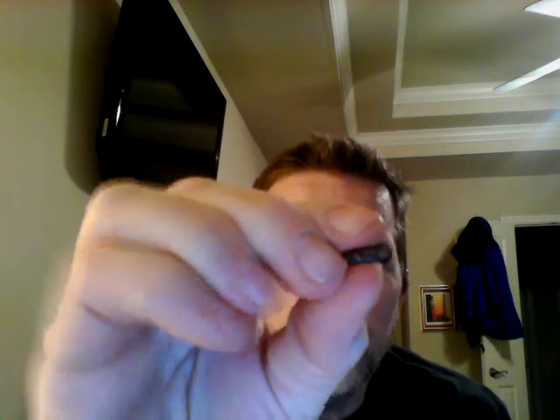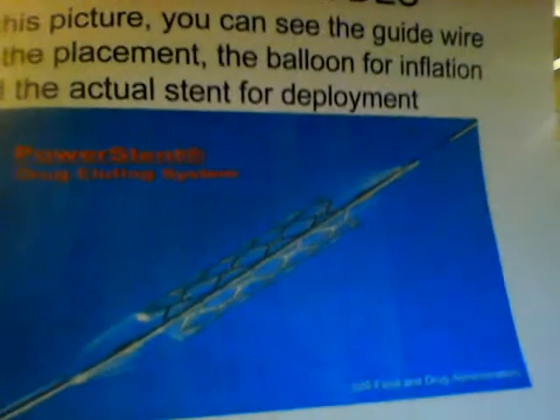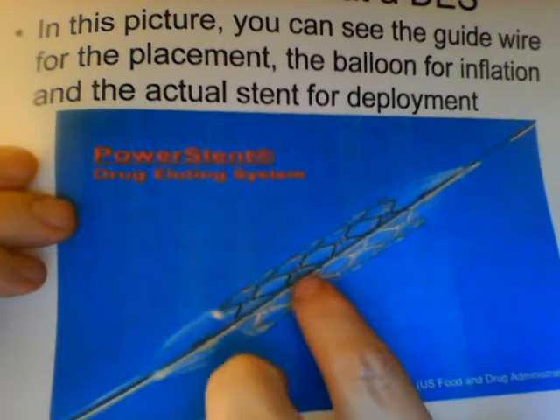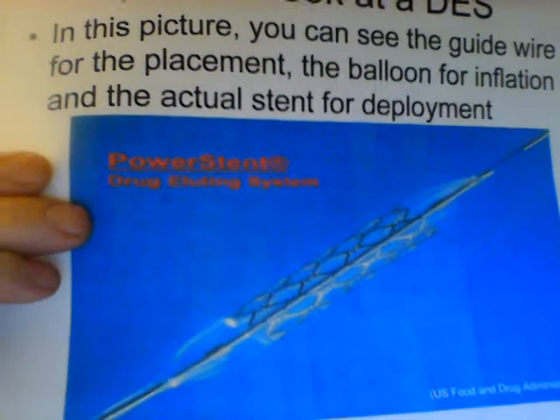So this would actually go into the coronary arteries. It would be inflated, and this is what would be left behind to help the blood flow through the coronary arteries. Another representation of that is this picture right here. There's three parts to the drug-eluting stent. There is the guide wire, which runs the full length of the stent. You have the balloon, which is the clear part here, and then you have the bare metal stent, or the drug-eluting stent, which is mounted onto this balloon.